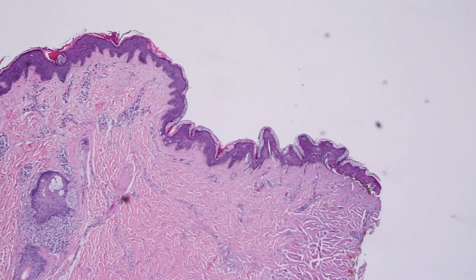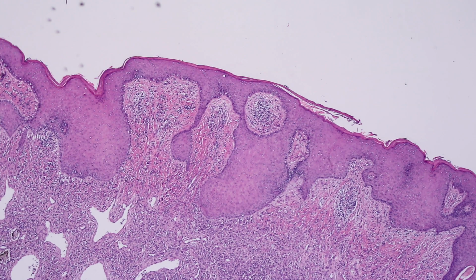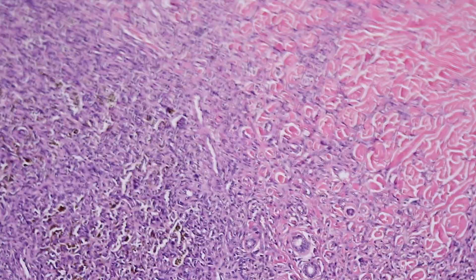And then look, as comparison, that's the normal skin out at the periphery. And that's the epidermis over the tumor. Massive epidermal hyperplasia or epidermal induction, a very classic feature of dermatofibroma. Over here, and I think you tend to see this best at the superficial portion of the lesion towards the periphery, you can see collagen trapping. And it's really nice here.